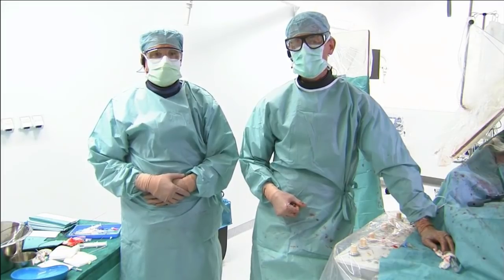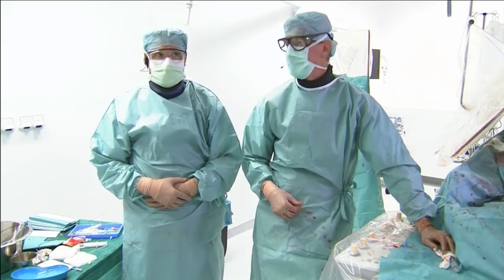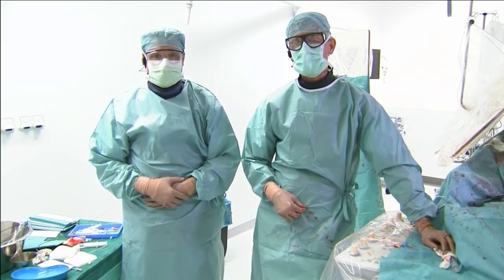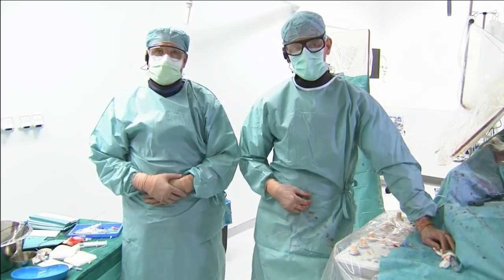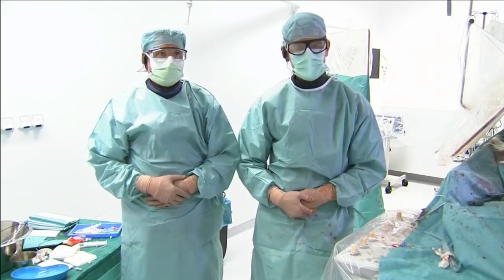Yeah, thank you very much, first of all, for inviting us to participate. It's really a big honor for us and a pleasure. With me is Sven Bräumlich. He is one of our seniors here in the lab for many, many years. Well, you see, we started already a little bit on our first case.